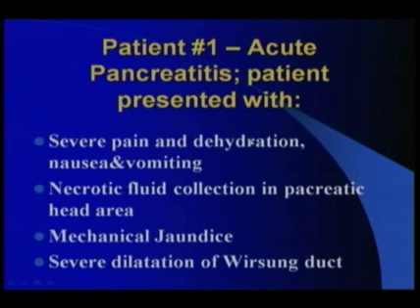Now I'd like to present some cases which can show the possibility of ultrasound in Wirsung duct intervention. This patient had acute pancreatitis. Patient presented with severe pain and dehydration due to nausea and vomiting. Necrotic fluid collection was detected in pancreatic head area. Patient had mechanical jaundice, so the necrotic fluid collection stopped the CBD, and severe dilation of Wirsung duct has been detected.